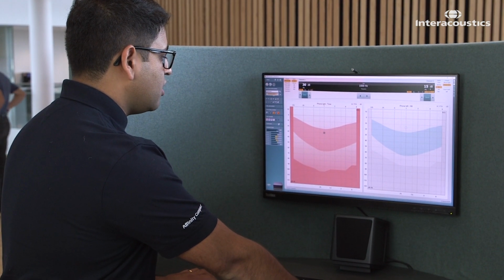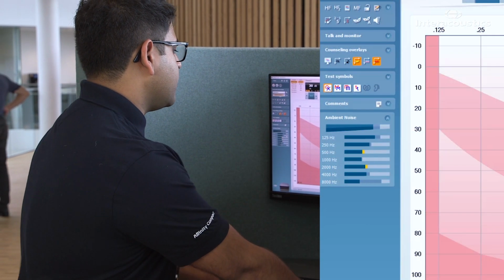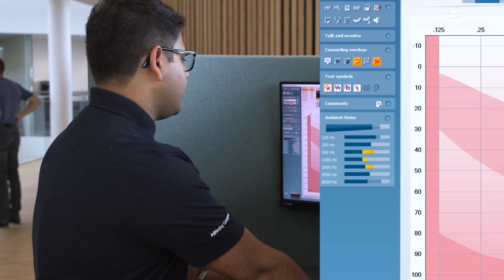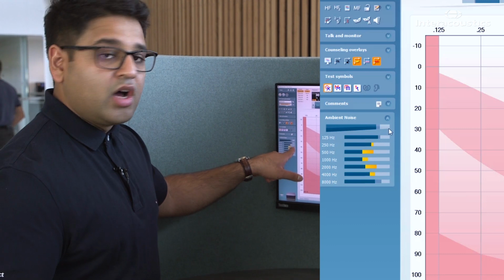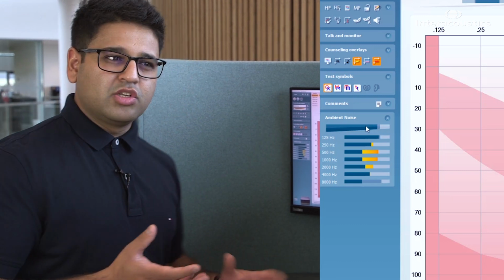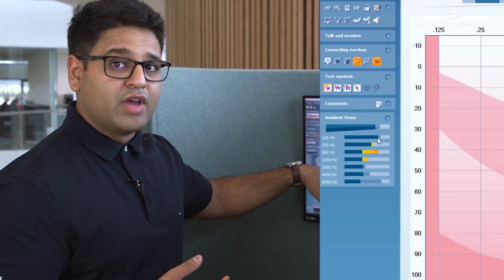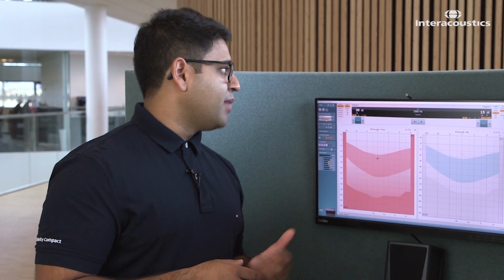And if the level is below the indicator or the bar, as you'll see here at 125 Hertz, then it will be fine and we're not working in elevated levels within the environment. If you look at these levels here, where they're slightly elevated at 500 and 1000 Hertz, the indicator will highlight yellow-orange, which means that when I'm testing at these frequencies, if I was to store a threshold and this noise level was to persist, then maybe it discredits the quality of that audiometry point. So it may make me want to rethink and re-edit that ahead of storing that point again. So, yep, this Affinity Compact ambient noise feature helps us to get real good quality audiograms when we're going ahead in our fittings.